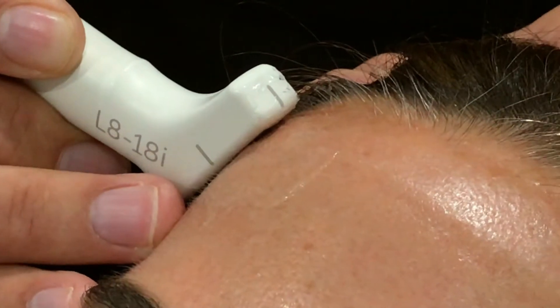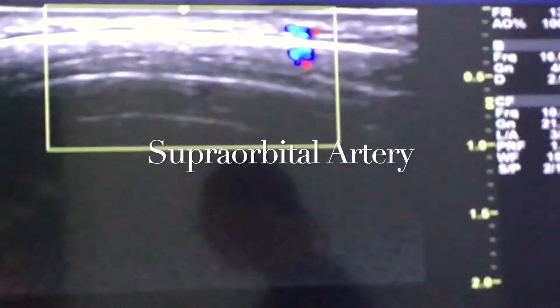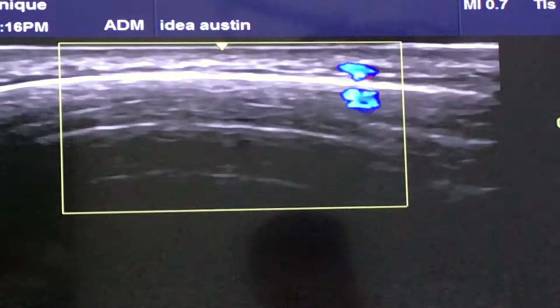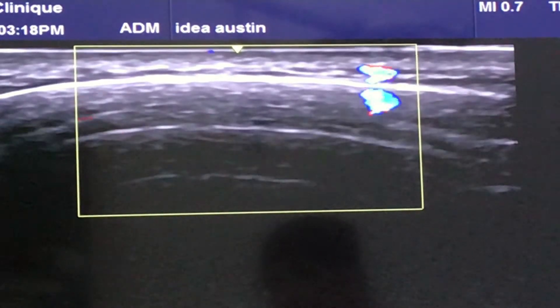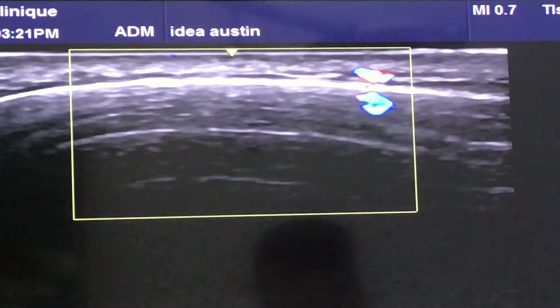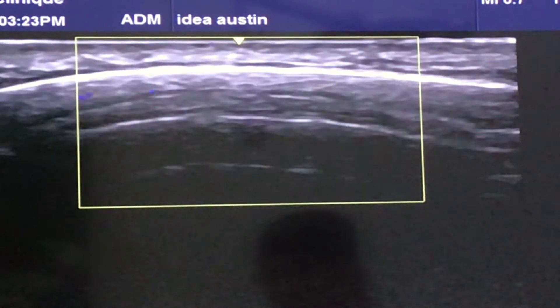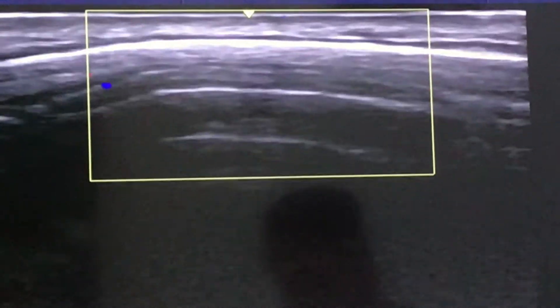What I'm doing here is looking at the supraorbital artery higher up in the forehead. You see it becomes much more superficial — remember, it was around five millimeters deep earlier; now it comes to two millimeters deep.